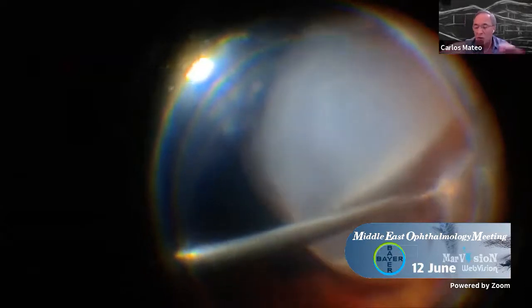This is an option for these kinds of eyes. The surgery is complex, but we do the vitrectomy. Then we detach the retina, as you can see here. We detach the retina by making an infusion in the subretinal space. Then we are going to cut the retina in 180 degrees. We have to flip over the retina, as you can see here now. Some surgeons prefer to cut the retina with scissors. We cut the retina with the vitrectomy tip. I think with these smaller gauge vitrectomy tips, you could do pretty well.